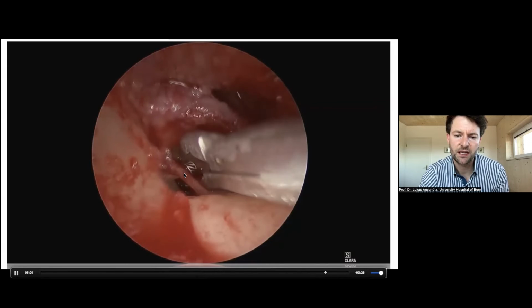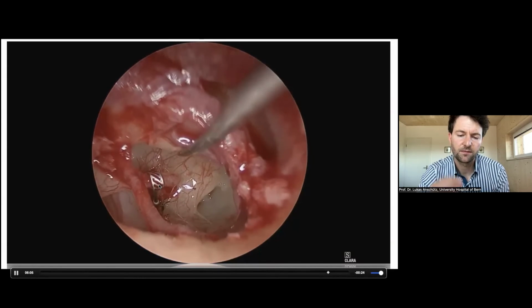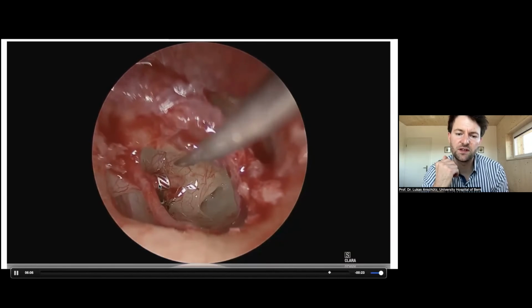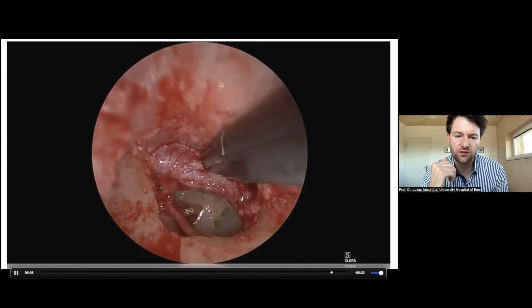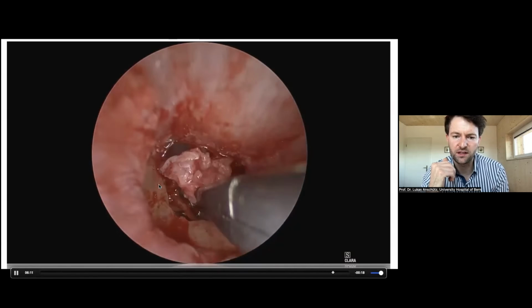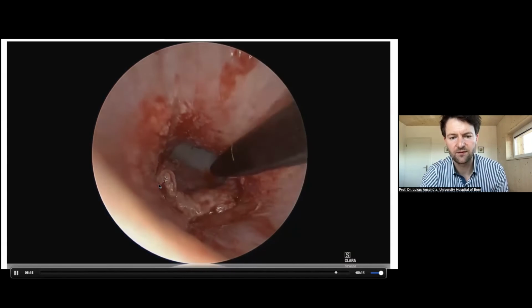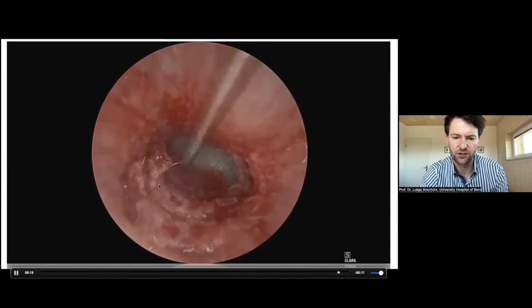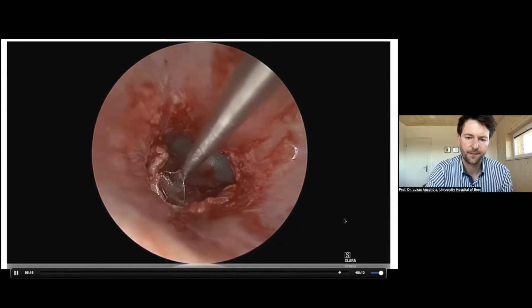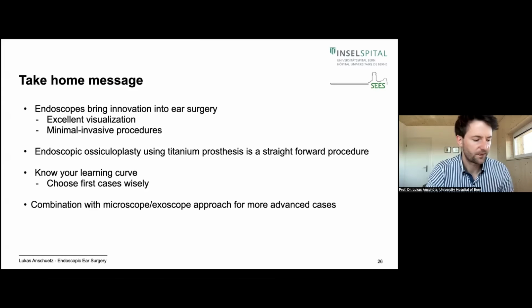I like this quite broad side of the prosthesis, because it allows me to really have a good contact to the incus without compromising its vascularization. Then we can put back the flap, put in our silk, and the surgery is finished. So I think we are on a good way.